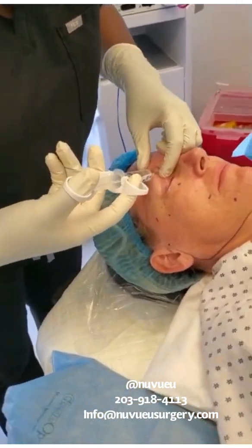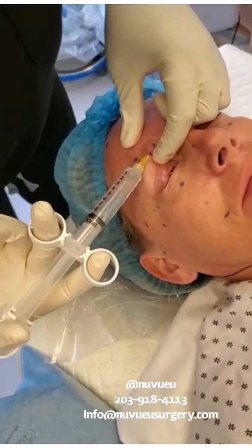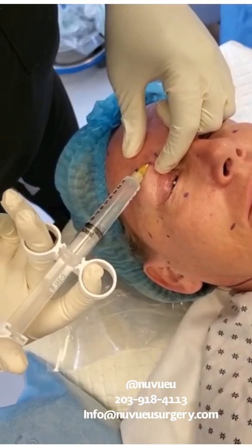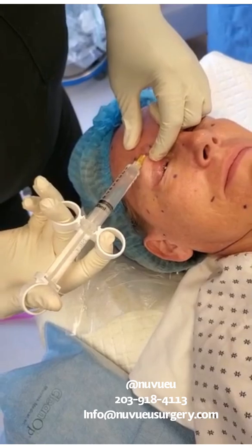You're going to move through the same opening. You're going to go medially about a centimeter down to get the supratrochlear. Again, you always want to aspirate, and then you're going to put in one cc.